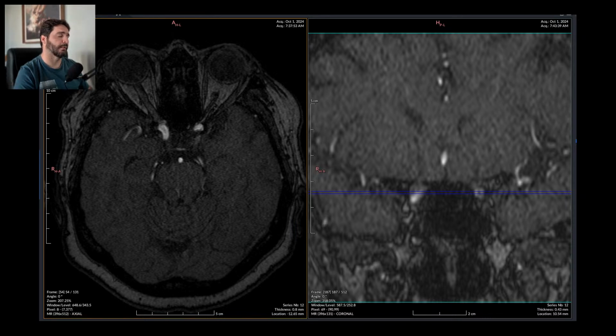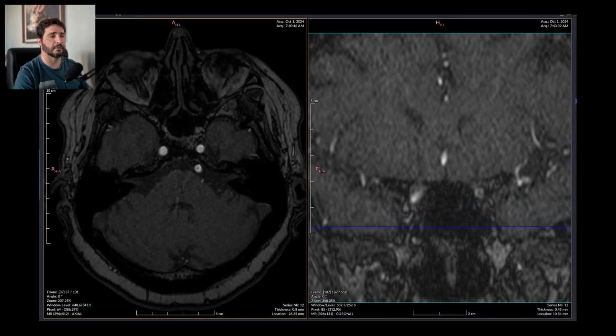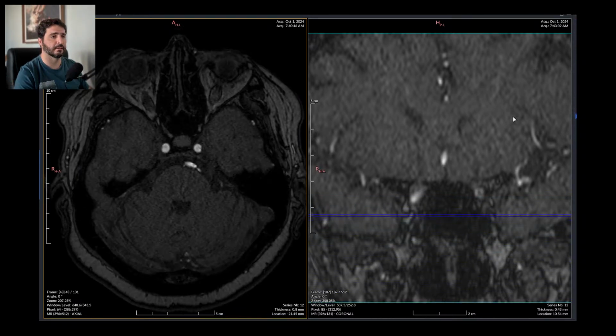For abdominal infradiaphragmatic staging, CT scan. For local staging and surgery planning, MRI is best. Non-contrast imaging for neoplastic disease, for cancer, usually is a bad idea. I wouldn't rely on that.